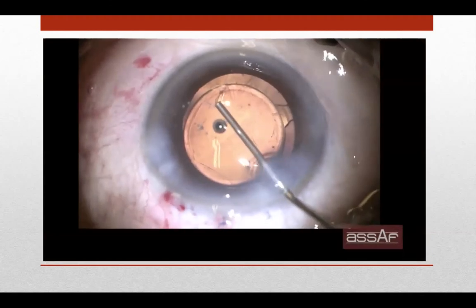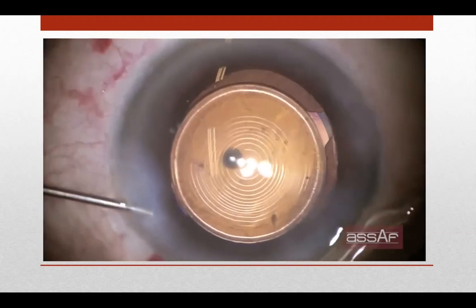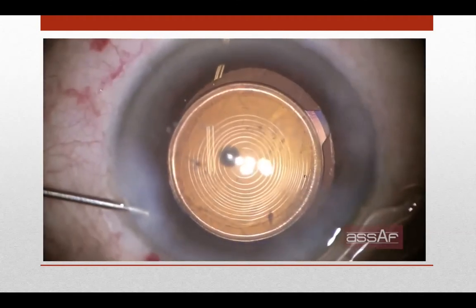If you have some cortical fibers, we can remove them with a dry aspiration in order not to disturb the anterior segment with the turbulence of the irrigation aspiration.